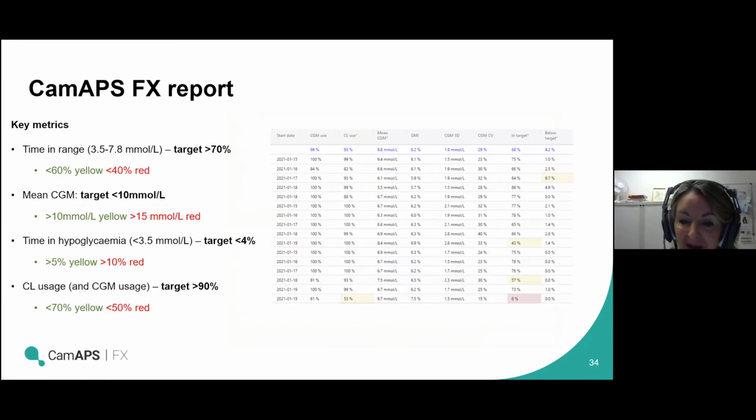This is one of our postnatal women. But we were able to look at this and say, oh, this is highlighted in red. There's a problem. Someone's only 6% time in range when she normally might be 60, 65, 70. And actually it was someone who'd run out of supplies, who'd run out of catheters and didn't want to bother anyone on the weekend. So you can be alerted very, very quickly and hopefully prevent an admission or a DKA by keeping a bit of an eye on those.